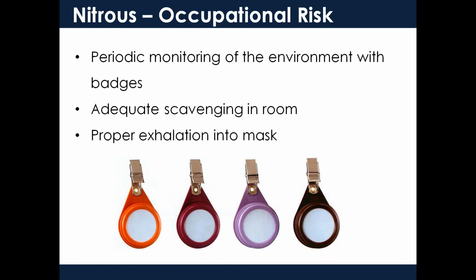And then, do the nitrous masks stink like oxygen masks? I like that question. I don't think they do. I don't know what an oxygen mask smells like. It's the padded anesthesia masks that they're using. So it is different, you're not pinching it around a nose. It's not form-fitting like an oxygen mask. I'm not sure I ever have put one on my face, but it's not exactly the same. And because it's intermittent, I haven't had anybody complain about it. And if they don't like it, they just disassociate from it. And that's all the questions so far.